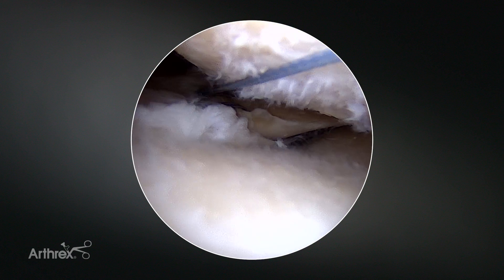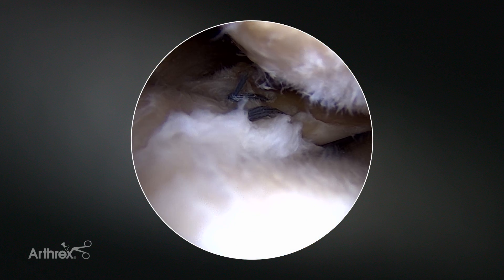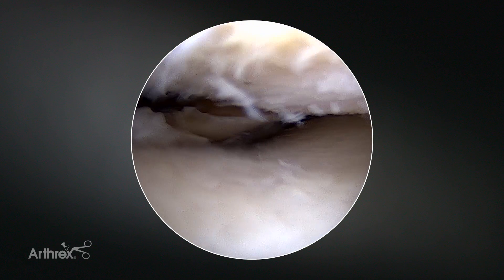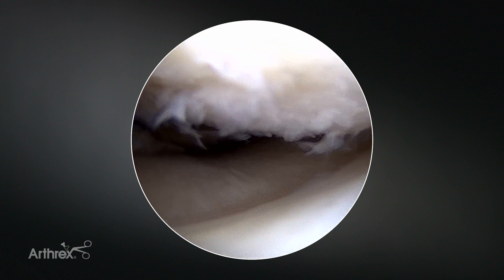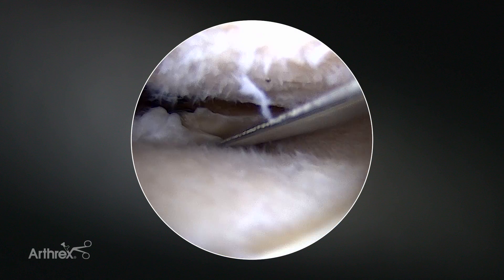The sharp bevel and the small size makes this pretty much the perfect all-inside meniscal repair device. It really lets me do anything and everything I would need to do with the all-inside device, really no matter what the anatomy of the meniscal tear would be.